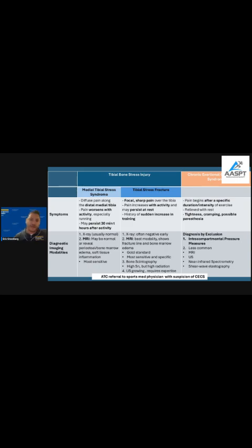Near infrared spectrometry that really evaluates the amount of oxygen saturation and changes in the muscle tissue with rest versus when they go under activity. And then also some shear wave elastography, where you tend to see some increase in shear wave modulus associated with the increased pressure after exercise compared to normal controls or healthy controls.